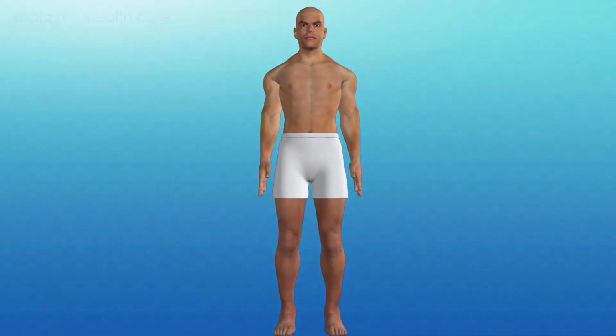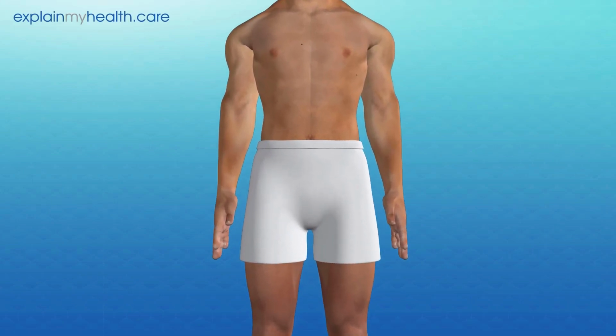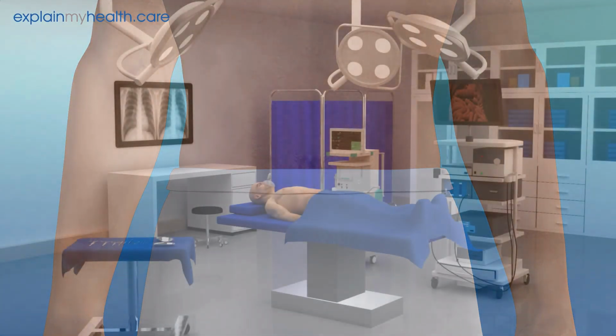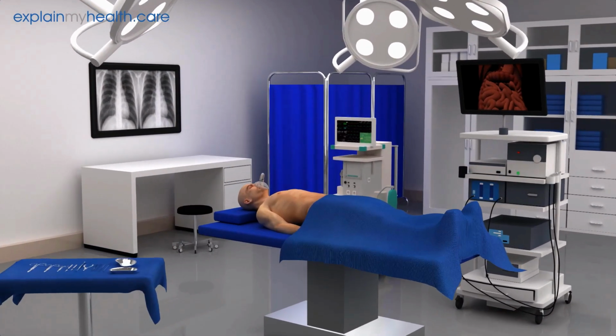During this video, we'll explain what's involved in a laparoscopic bowel resection. Bowel resection surgery involves removing the diseased parts of your small or large intestine. Laparoscopy is a type of surgical procedure that allows a surgeon to access the inside of the belly and pelvis without making large incisions in the skin. It's also known as keyhole or minimally invasive surgery.